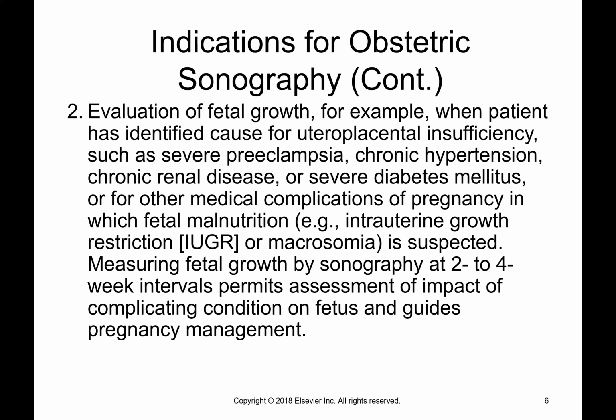Another indication is evaluation for fetal growth. If a patient comes in for small for gestational age, or the mom has an underlying growth condition, we will want to measure the baby in multiple different ways: the head, the belly, and the femur, and that will give us an estimated fetal age, which we are trying to see if it matches up with what the estimated due date should be. And we'll go into this more in the upcoming chapters.